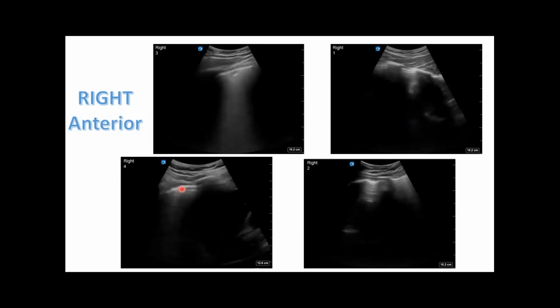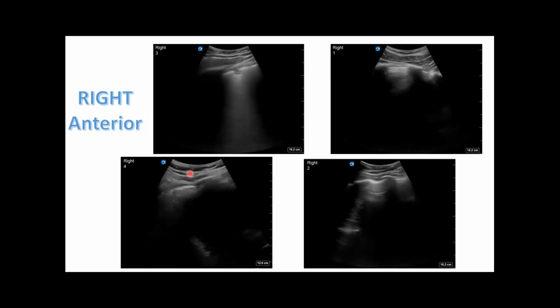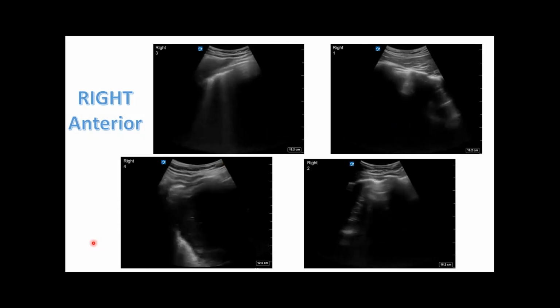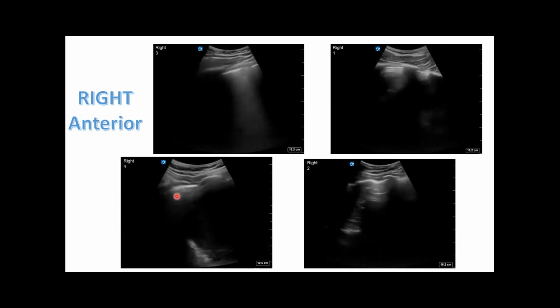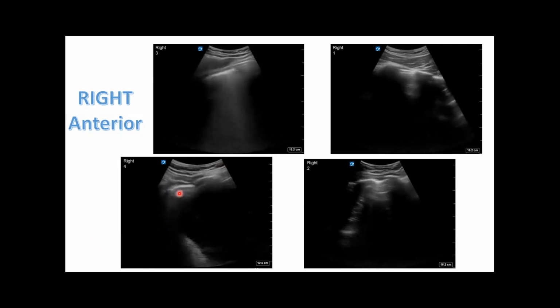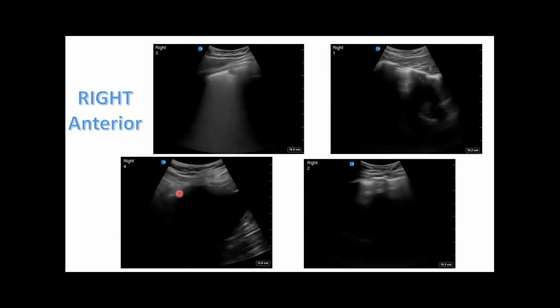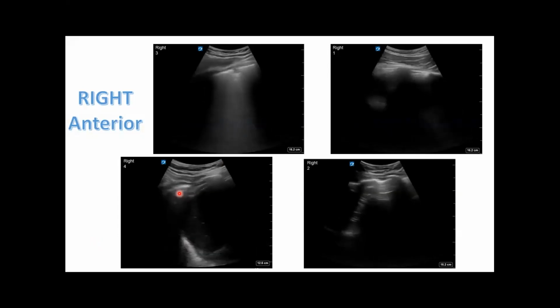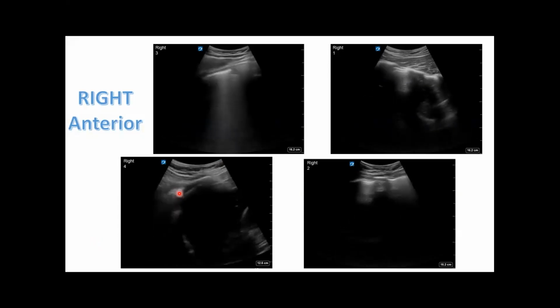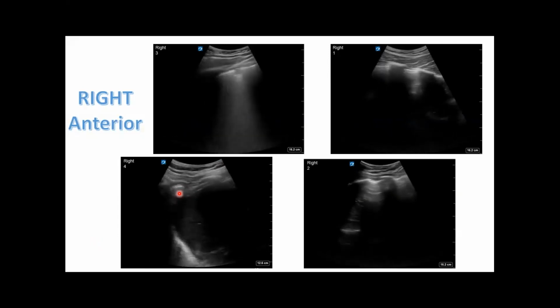So I didn't speed this clip up. What's another thing that you can take from this clip? Severe tachypnea. Yeah, so you can literally pick up him breathing like 40 times a minute. When Dr. Suzansky and I were in the room, we thought he was just anxious. We thought he had COVID, and we thought he was mildly anxious. So we did our whole exam and it didn't improve at all, his tachypnea.